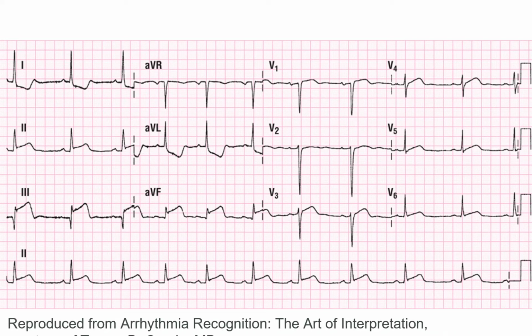Yes, good. Looking at lead 1 first, then AVL. Neutral, depression, elevation? Depression in 1. AVL, depression. 2, elevation. 3, elevation. AVF, elevation. Right now, we think we have what? Inferior STEMI. You can't just tell me STEMI. So inferior STEMI, because we have elevation with depression.